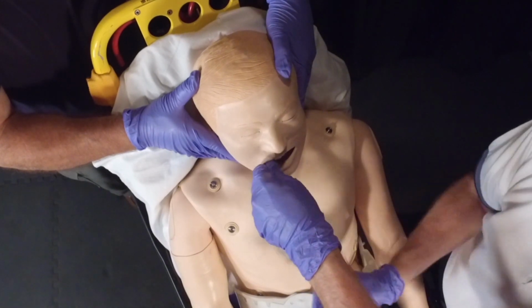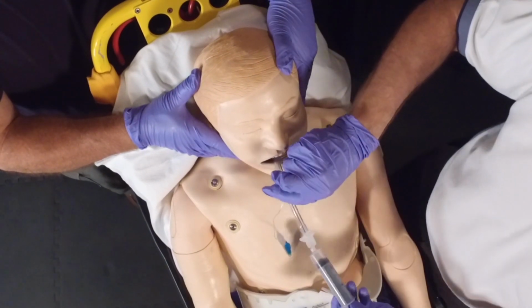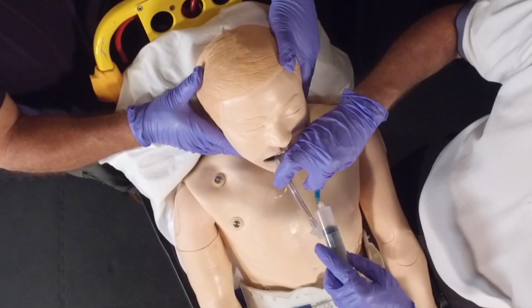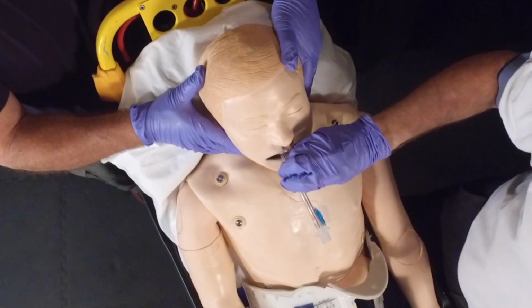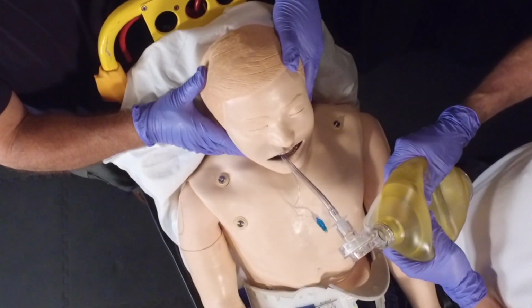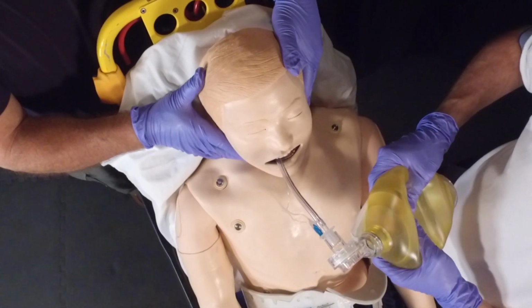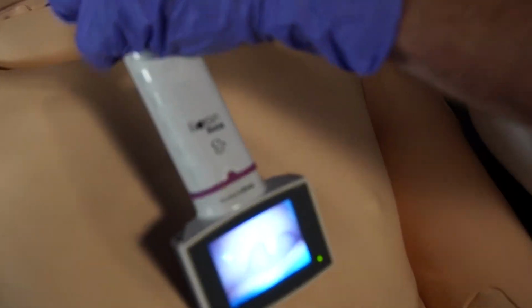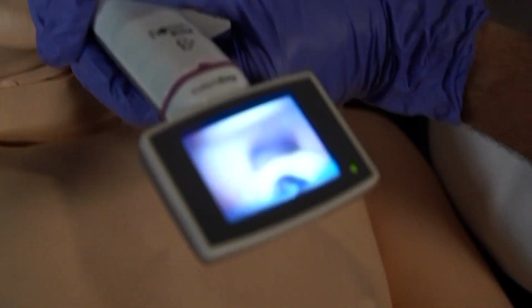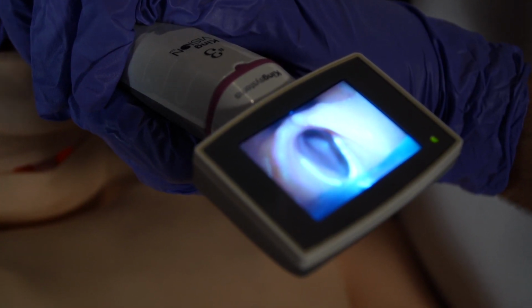Once the tube is in, just like any other intubation, inflate the cuff, apply your ventilation device, listen to epigastric sounds, lung sounds, chest rise, and measure end-tidal CO2. Immobilize the tube and the head as you do in any other intubation. Just to give you an idea of how this looks doing the intubation from the front, we've placed a video camera laryngoscope in the same position.